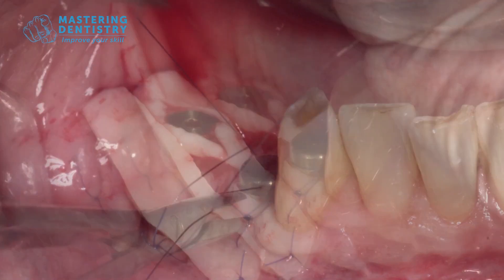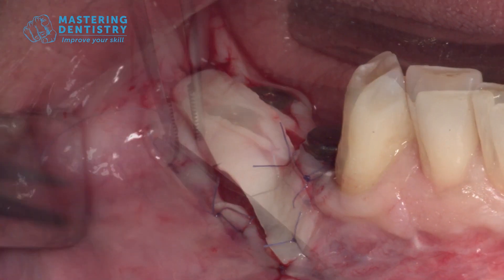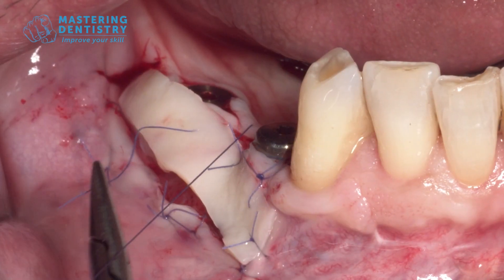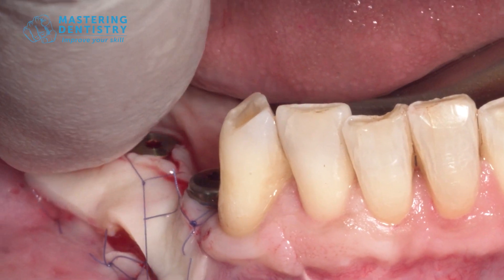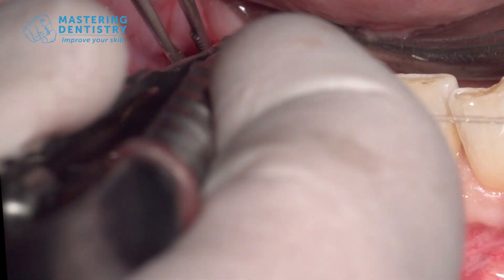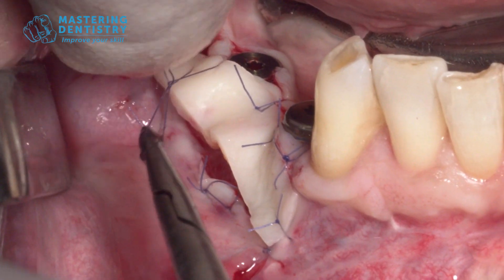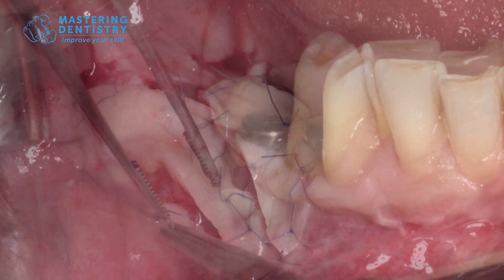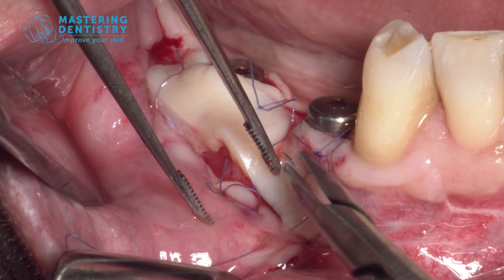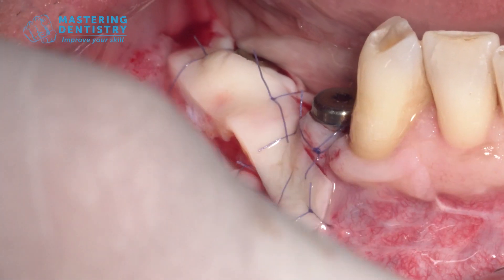We go on with other sutures all around. In this phase we perform all interrupted sutures, taking the surrounding tissue and passing through the periosteum to get good stabilization of the graft. We start from the mesial, then we go to the occlusal portion from mesial to distal, anchoring the sutures to the surrounding keratinized tissue and to the periosteum. This is a 6-0 PGA suture.